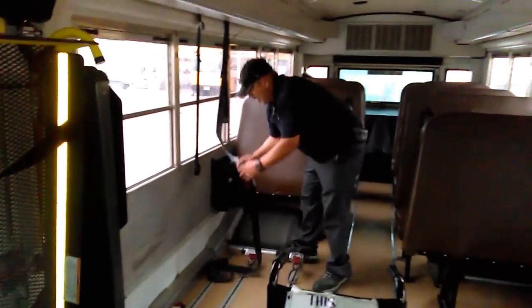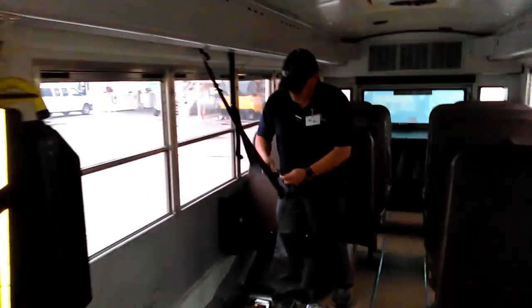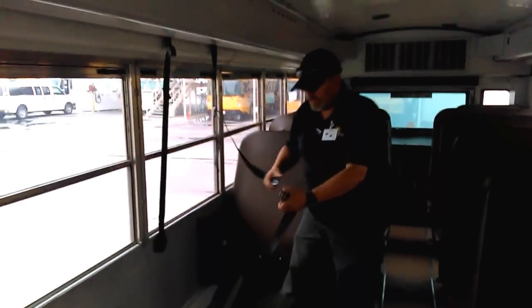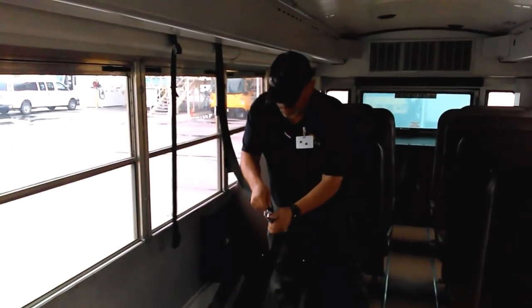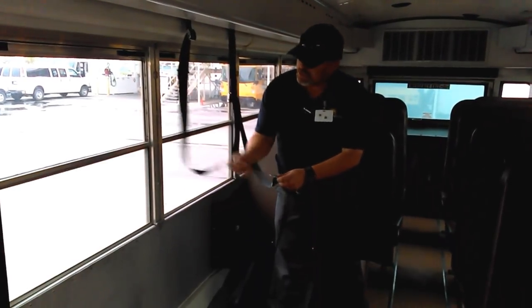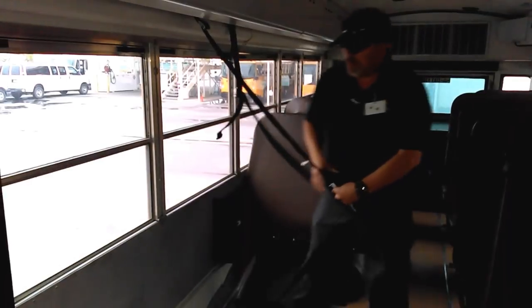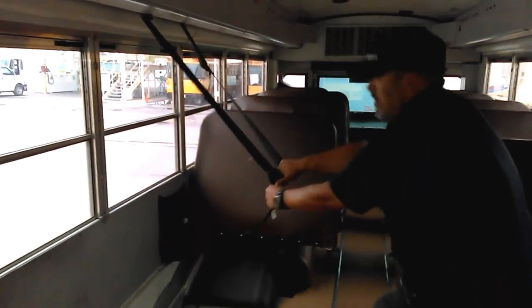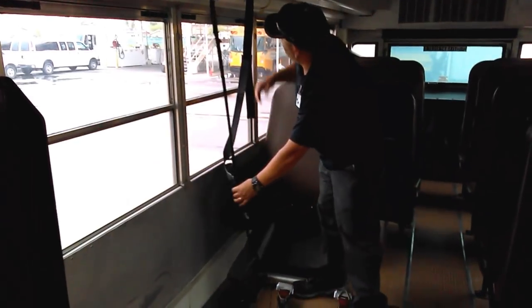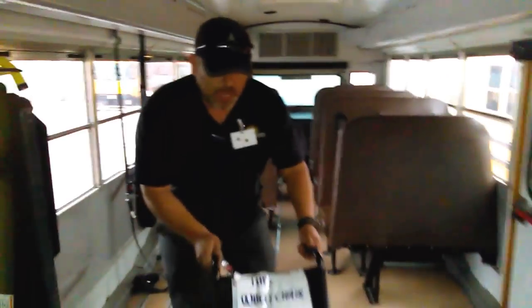This is a three-point belt, a three-point system — one, two, three. It has a little latching on the bottom for the clip, and you secure it to your belt like this. You also want to make sure you check that everything works — give everything a good pull and confirm it holds.